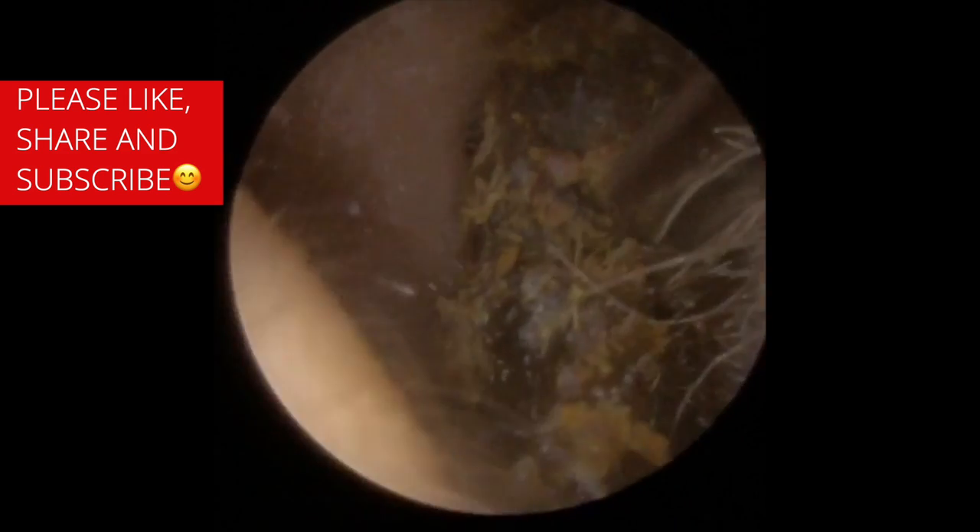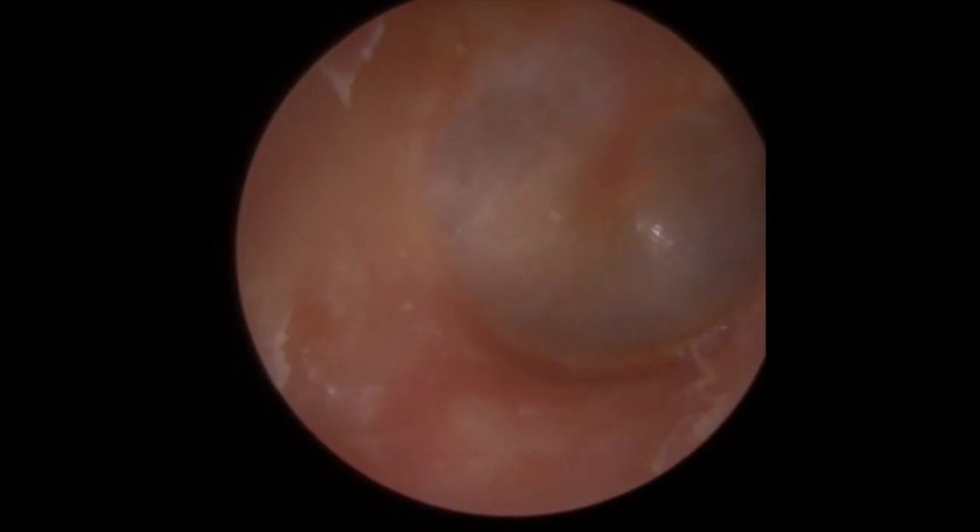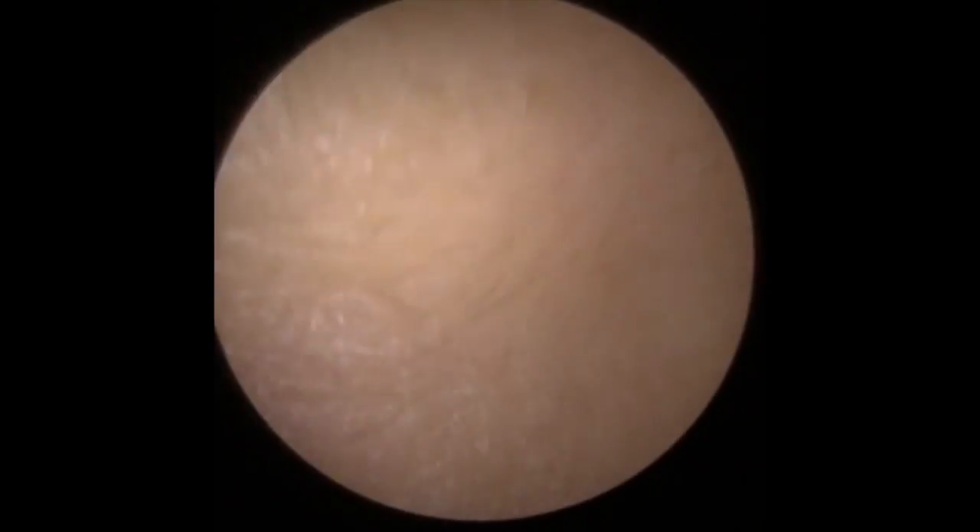Just picking that up to show you — it gives you some appreciation of how long this was. Lots of dry skin underneath. You can see now why you shouldn't really go blindly in with a Jobson horn. Somebody could have pushed quite far in to do that and you wouldn't have got to the end.